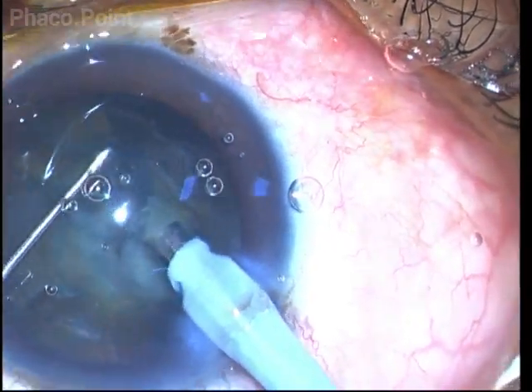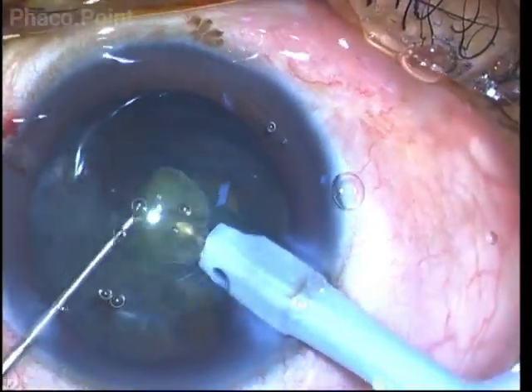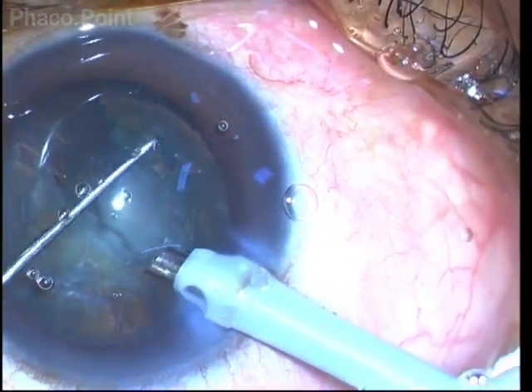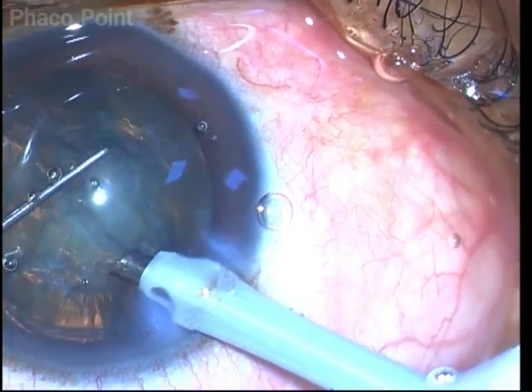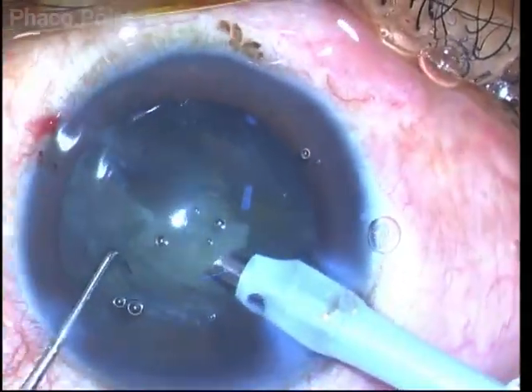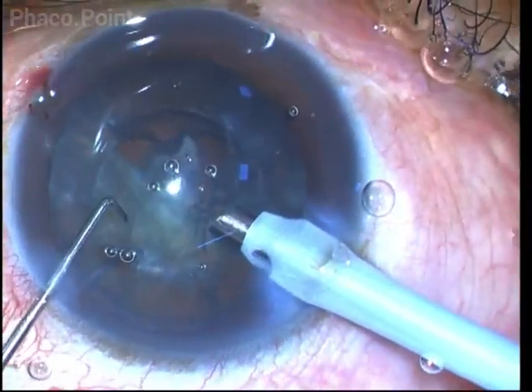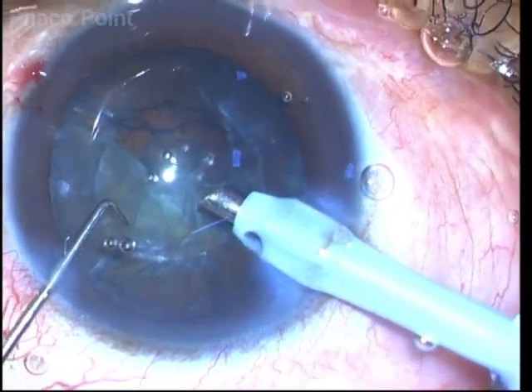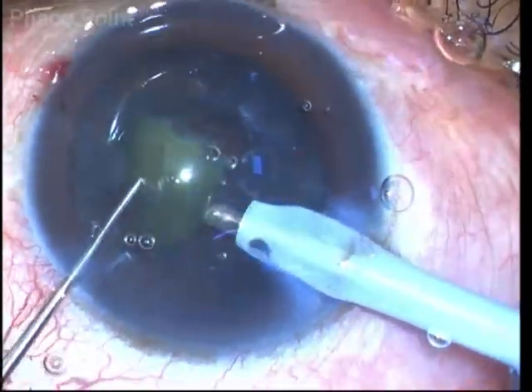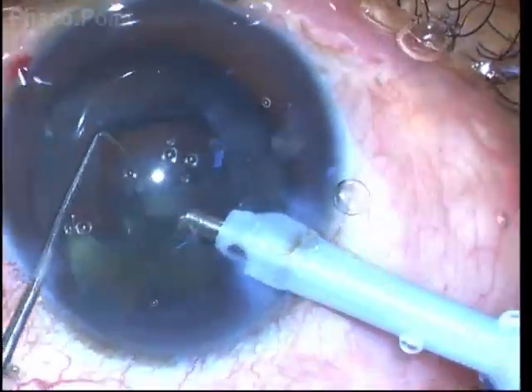I then create another pie-shaped fragment with further chopping, and this is carefully emulsified and mobilized. The resultant half of the endonucleus can simply be prised out of the capsular bag with the help of the sharp chopper and emulsified. The other half of the endonucleus can then be moved out of the capsular bag by impaling it with the phaco tip, drawing it out, bringing it to the safe zone, and carefully emulsifying it.